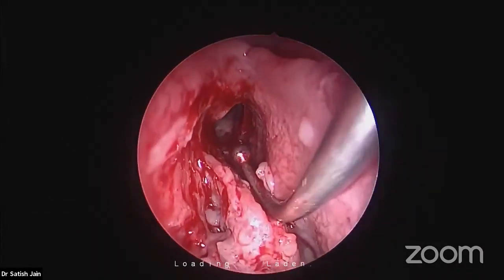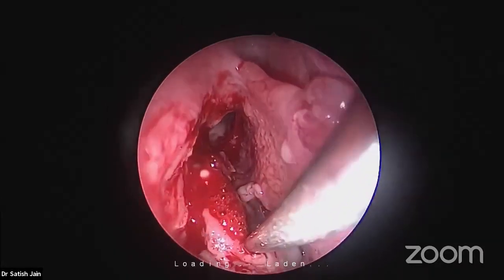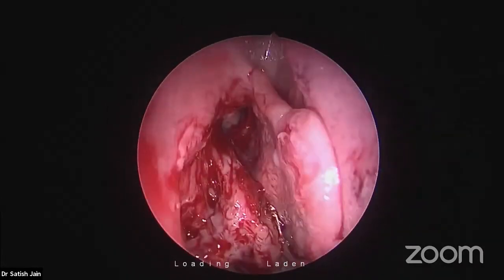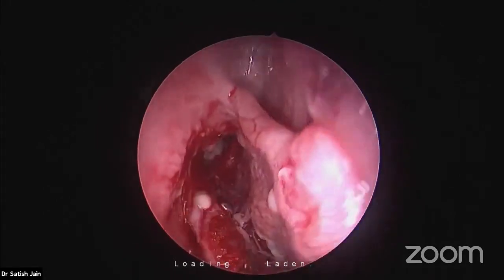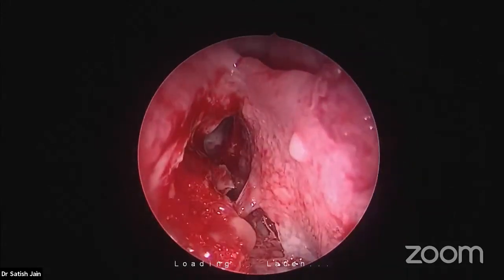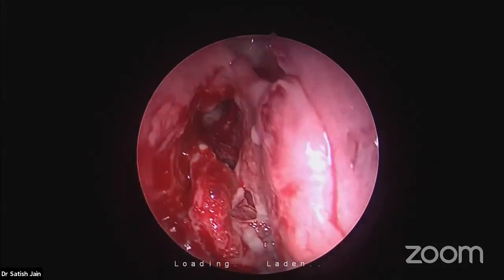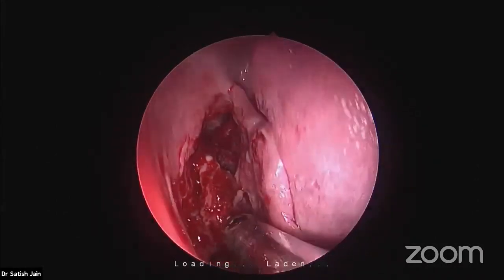And behind the bulla is the anterior ethmoidal artery. If I fracture this bulla like this, you will find the anterior ethmoidal artery protected by it. And that's a very good protection for the anterior ethmoidal artery. Now, what Dr. Kranti is asking about is the suprabullar cell.